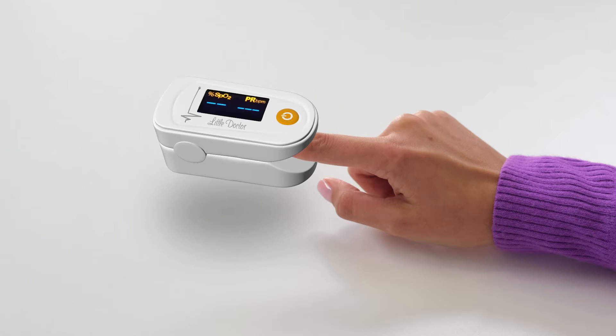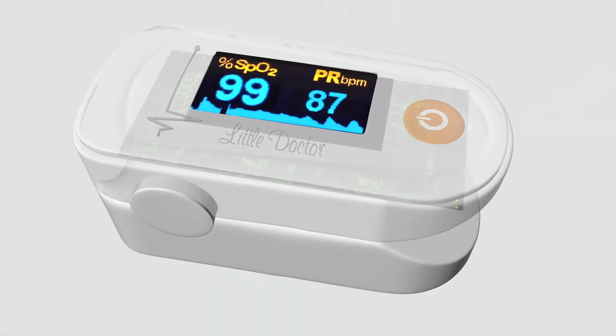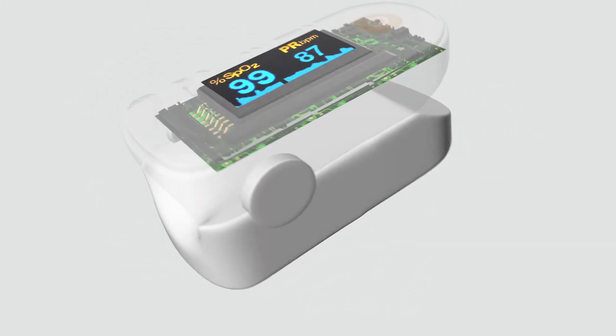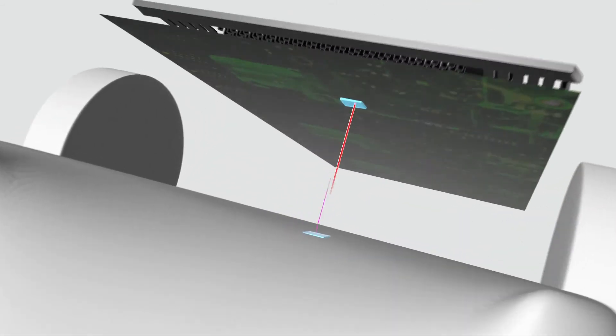After a couple of seconds, the display will show the blood oxygen saturation and pulse rate. A distinctive feature of this model is a very bright and high-contrast color display that allows you to easily see the measurement results in any conditions.